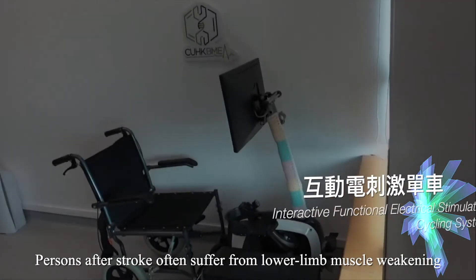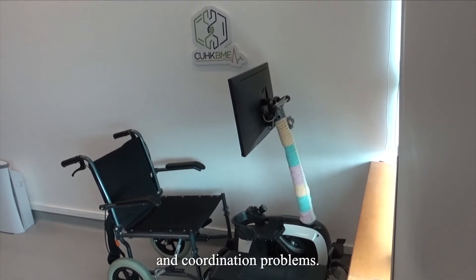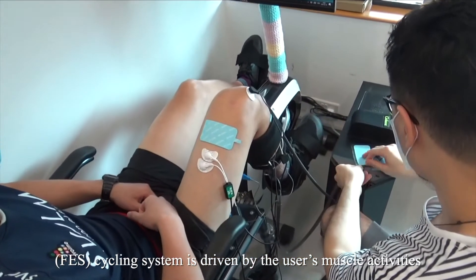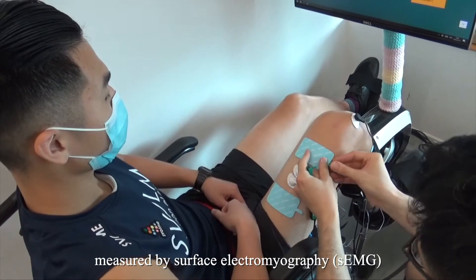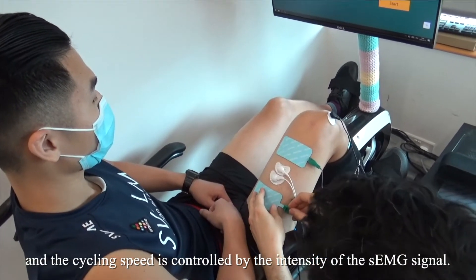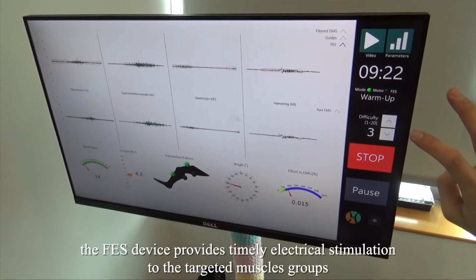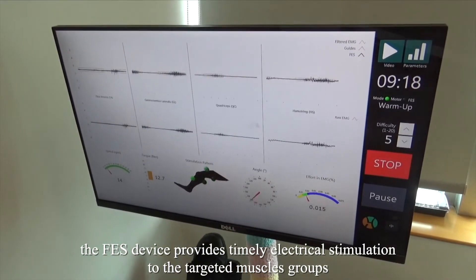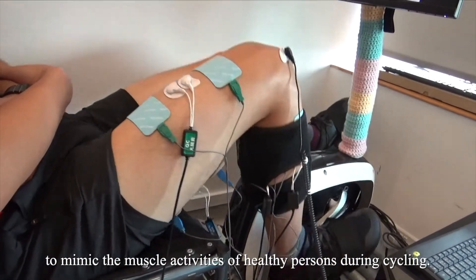Persons after stroke often suffer from lower limb muscle weakening and coordination problems. The functional electrical stimulation cycling system is driven by the user's muscle activities measured by surface electromyography, and the cycling speed is controlled by the intensity of the signal. In conjunction, based on the cycling phase, the FES device provides timely electrical stimulation to the target muscle groups to mimic the muscle activities of healthy persons during cycling.